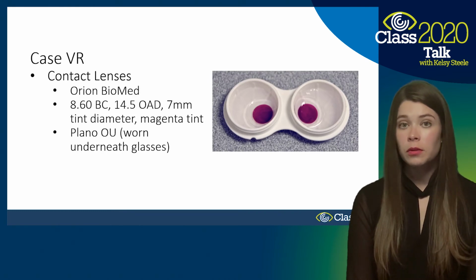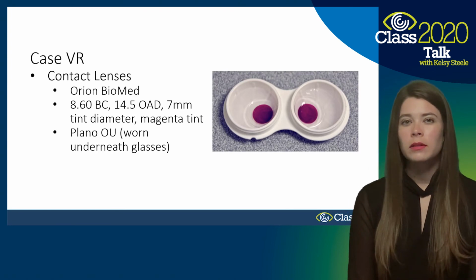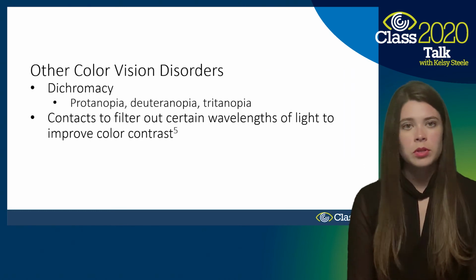And sometimes that is a good recommendation, especially if you have patients with low vision. They might need to be wearing some impact resistant lenses over top of their contact lenses, just from a protection standpoint.